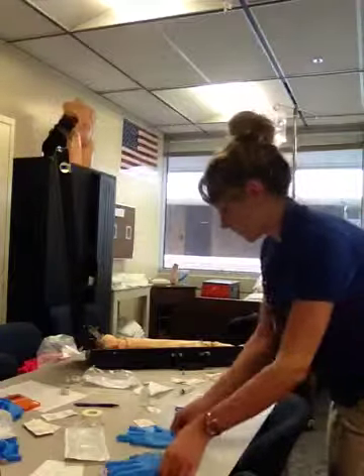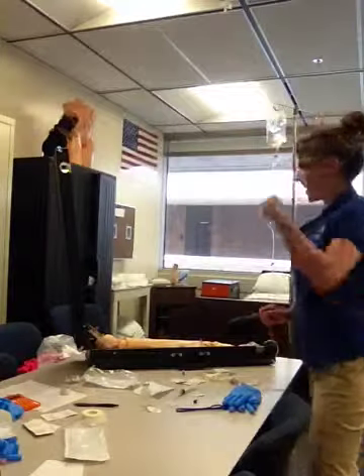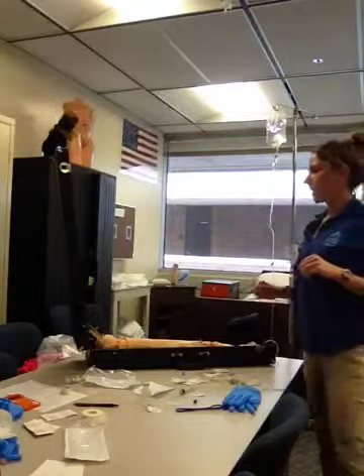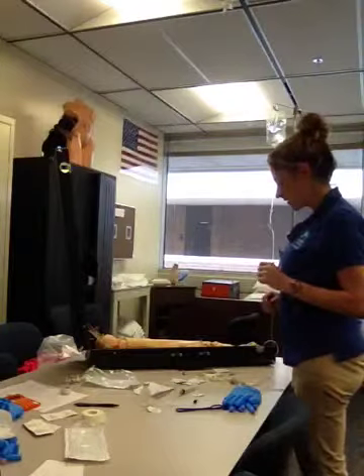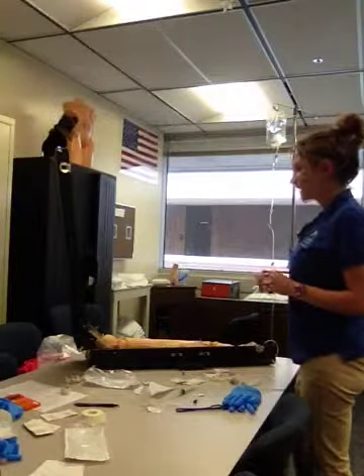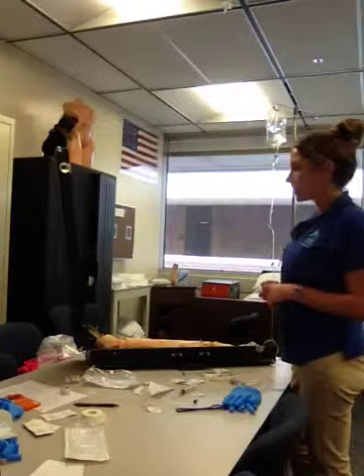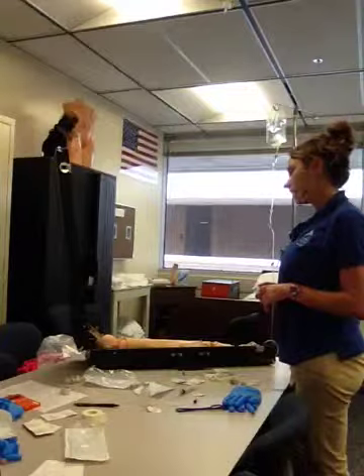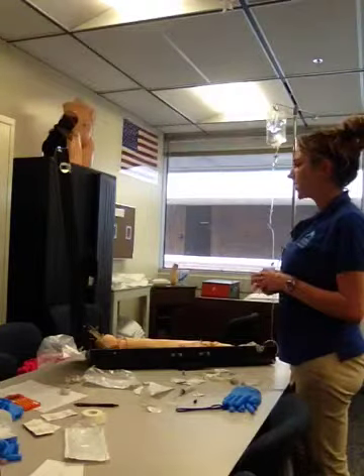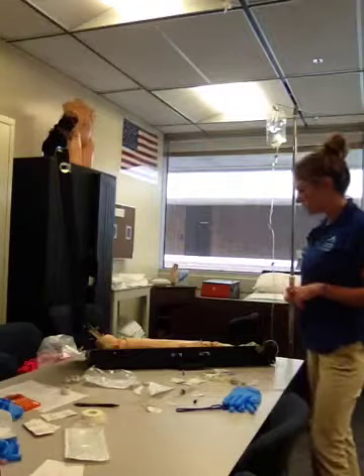All right, I'm going to go into the patient's room, and I'm going to say, hi, Mrs. White, my name is Katie, and I'm your nurse today. I'm going to be administering some antibiotics through your IV line. I'm going to ask for two patient identifiers, being name and date of birth, and I'm going to ask Mrs. White if she has any known allergies to penicillin especially, and other antibiotics, such as cephalosporin.